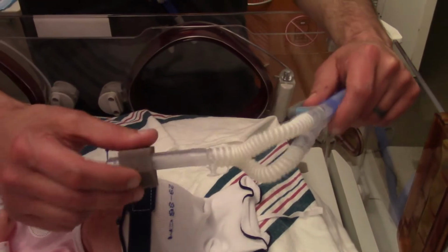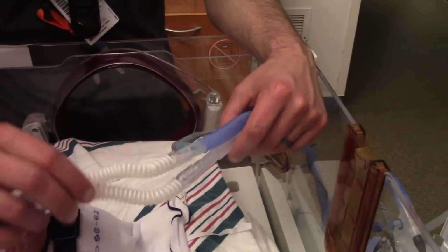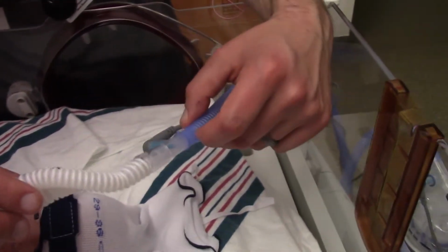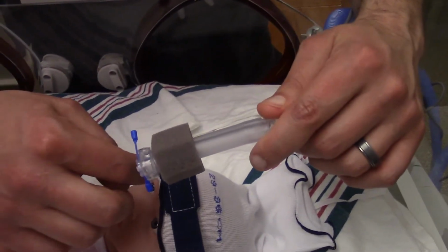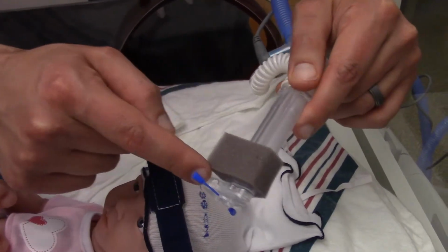Okay, so once we've determined our trunk, the two different limbs, we want to try to focus on putting the blue on top for a couple of reasons. As we know, the flow is coming through the blue inspiratory limb. That way it comes through the top and comes down right away instead of having to come down from the bottom.